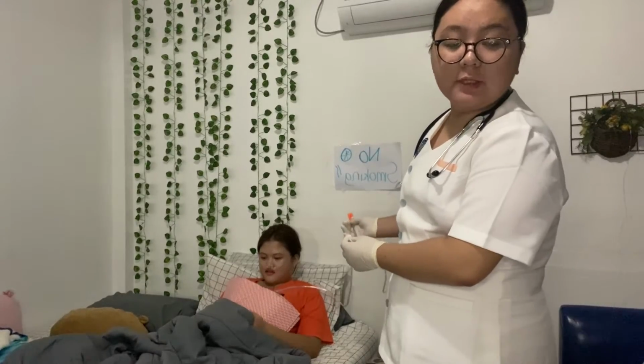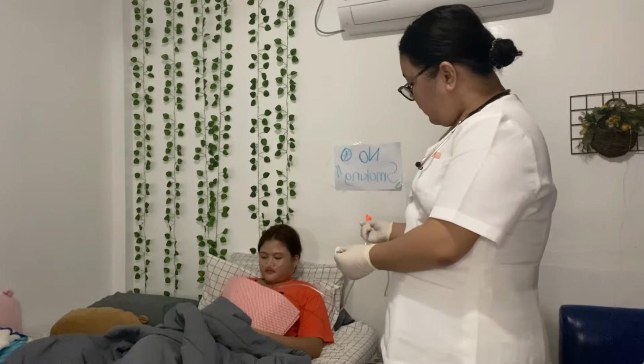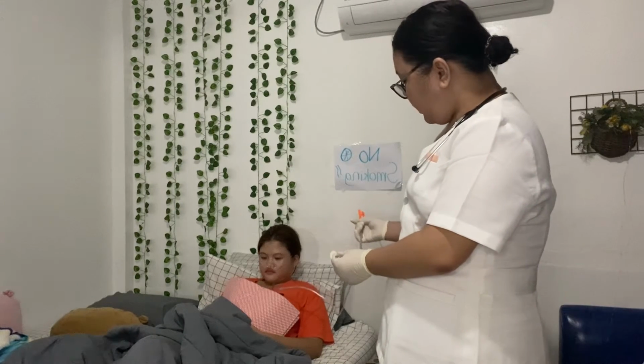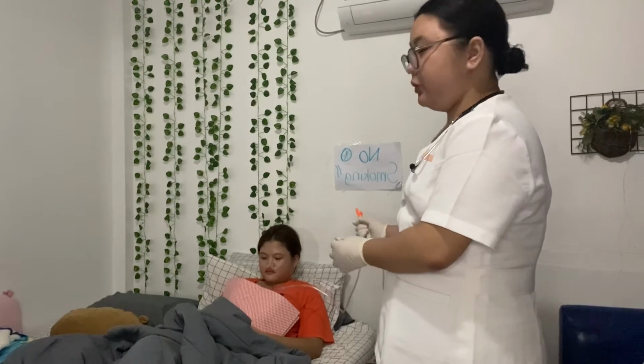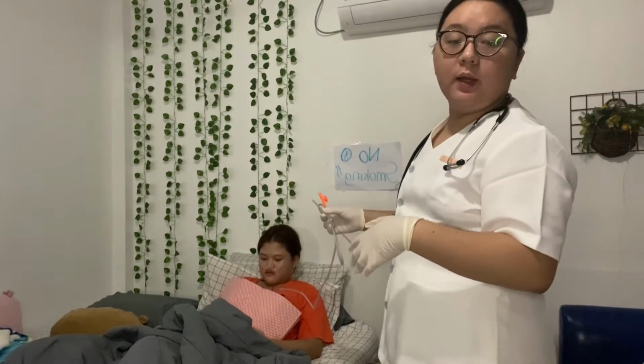So here it is. Test the equipment to see if it's functioning properly by suctioning a small amount of saline. So I guess it worked properly. No need to worry.